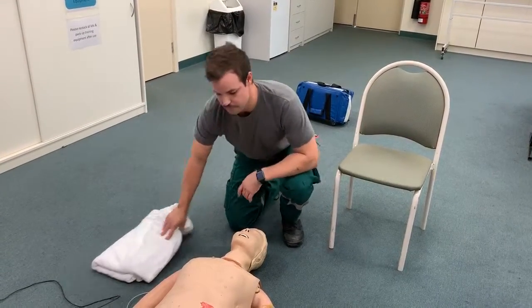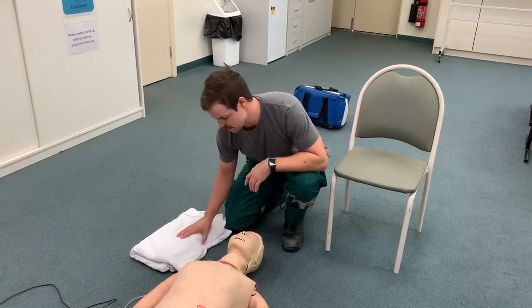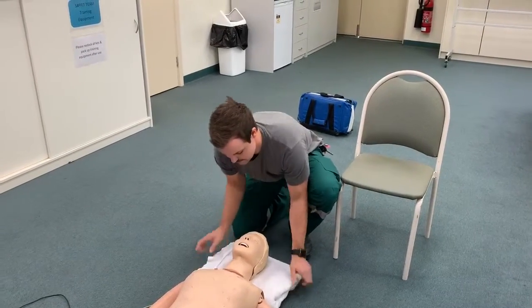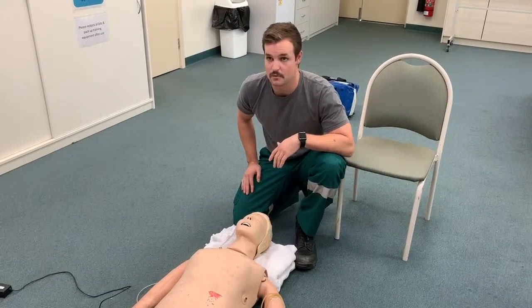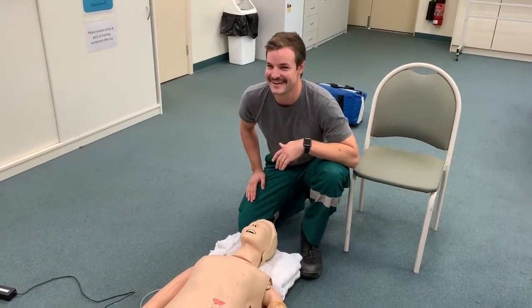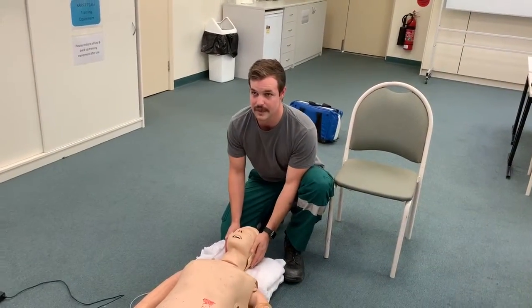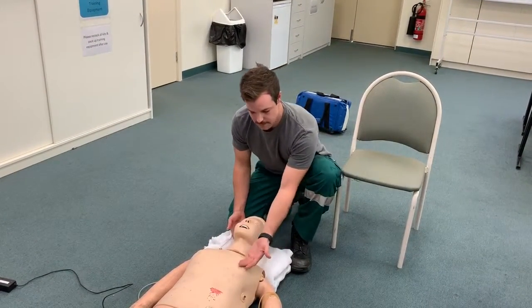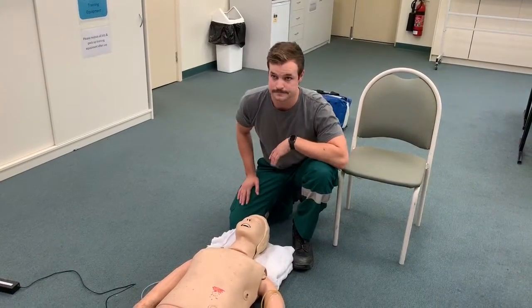If we need anything in terms of manipulating the patient into a better position, we can use a ramping technique, which is basically getting the patient to lean forward. We've put our handy-made towel here, and we're going to be looking for the three-axis alignment. We're going to look for the laryngeal, pharyngeal, and the mouth alignment, which is here, here, and here. Also, you can go ear to sternum, which is another good alignment technique. So we can use either pillows, blankets, kits, whatever you like to get that view.